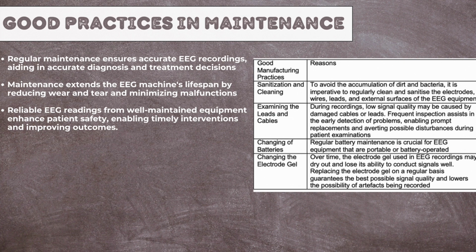Lastly, changing the electrogel. Over time, electrogel used in EEG recordings may dry out or lose its ability to conduct signals. Hence, replacing the electrogel on a regular basis guarantees the best possible signal quality.